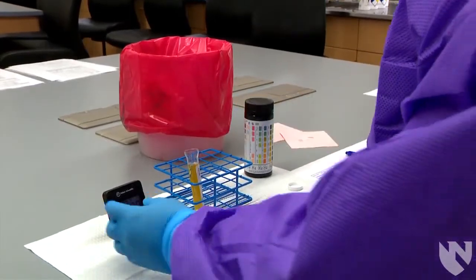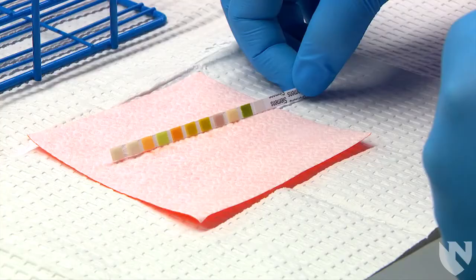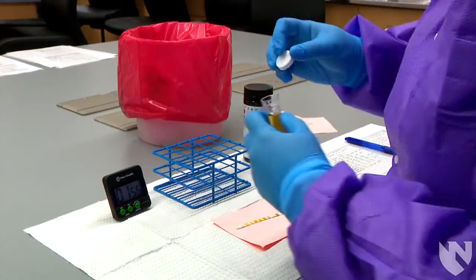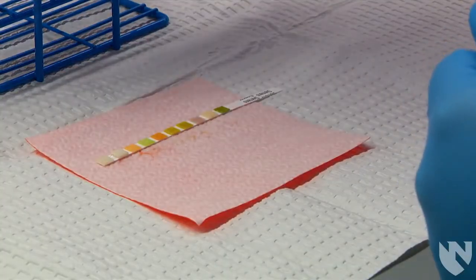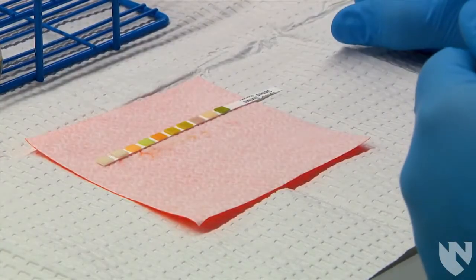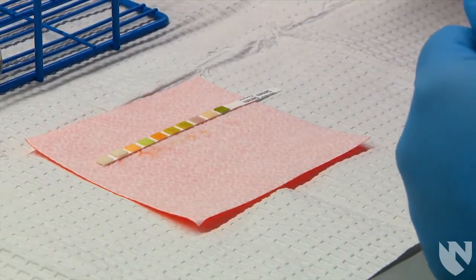Set the conical tube down, and with this now free hand, begin the timer. To prevent excess urine from cross-contaminating the reagent pads, hold the dipped reagent strip horizontally and touch the side of the strip to a paper towel or orange pad. Put a lid on your conical tube. You may set the dipped reagent strip on a paper towel with the reagent pads face up in order to put the lid back on your specimen if needed.